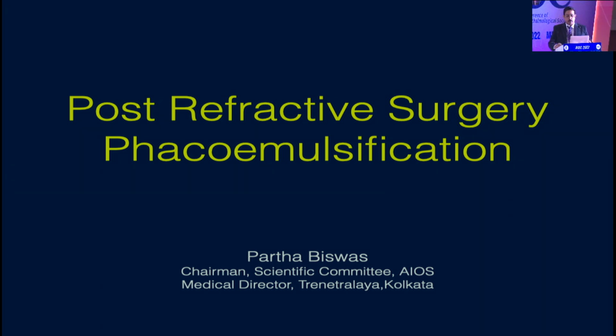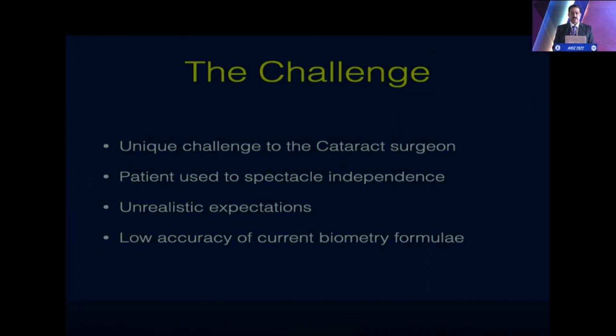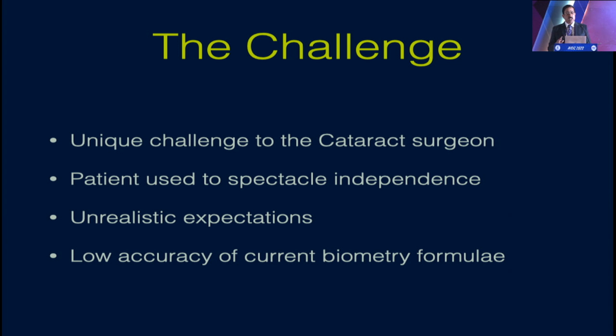Thank you very much, sir, for inviting me to this very valuable course that you have year after year. Post-refractive surgery phacoemulsification is something that we need to talk about, because though it might be a rare possibility in a crowded OT, when this possibility comes, one has to be absolutely on one's toes. So how do we approach a patient of post-refractive surgery phacoemulsification? What are the challenges?